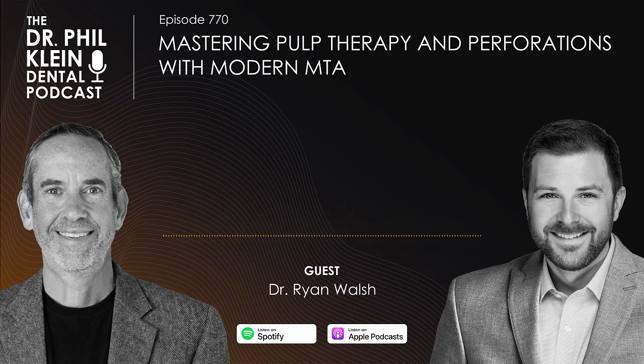Yeah, no, good advice. So earlier versions of MTA had some well-known drawbacks. Handling, setting time, like I mentioned earlier, is kind of long, which probably precluded some dentists from even using it. Staining, discoloration was one of the drawbacks. From your perspective, Dr. Walsh, how much have modern MTA materials improved the day-to-day clinical experience of using it?